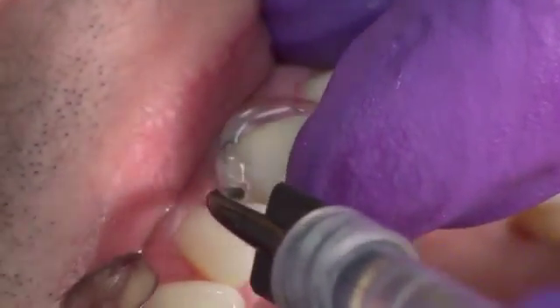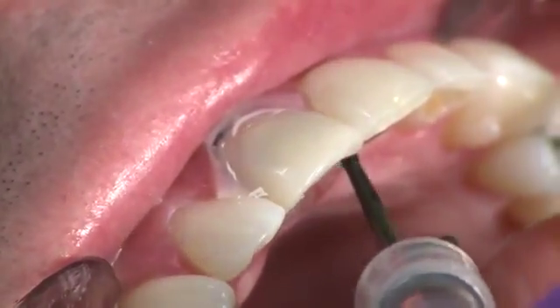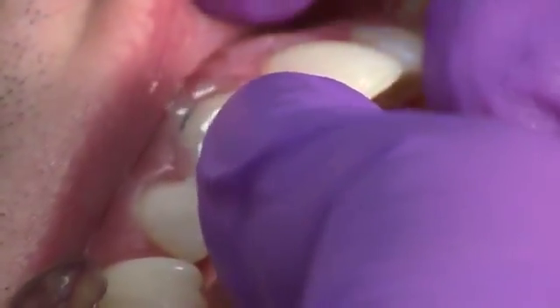Remove excess cement and apply Deox to prevent oxygen inhibition while the resin is curing. Light cure with the Velo curing light for 10 seconds on standard power mode.